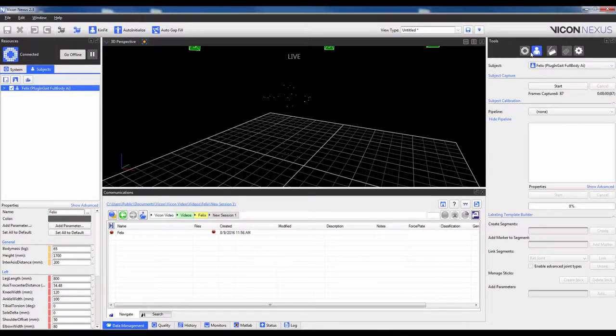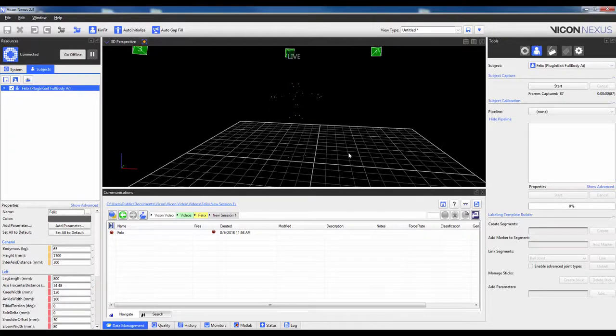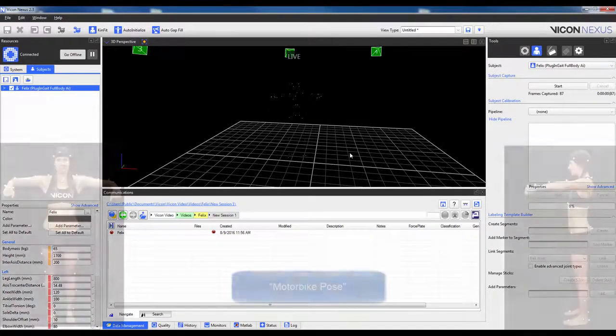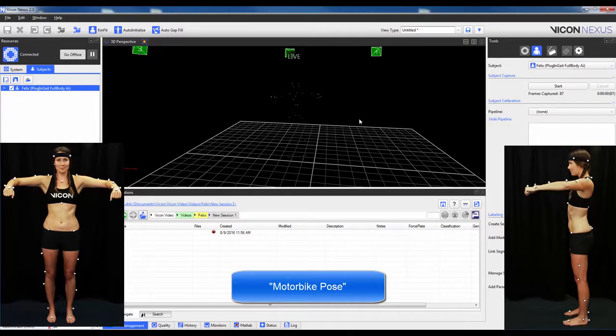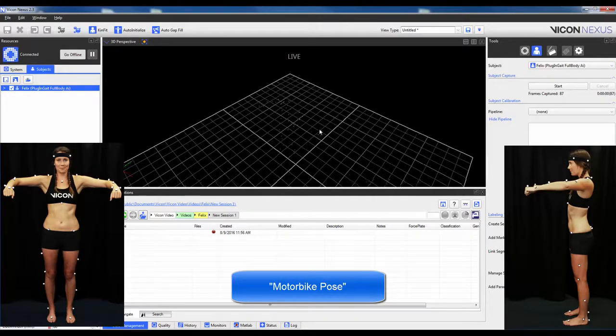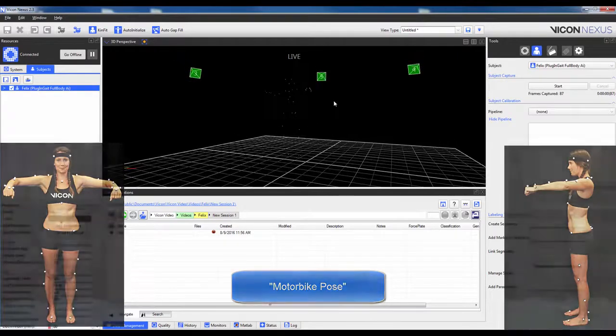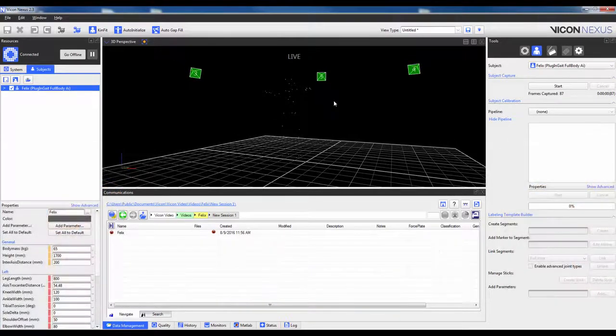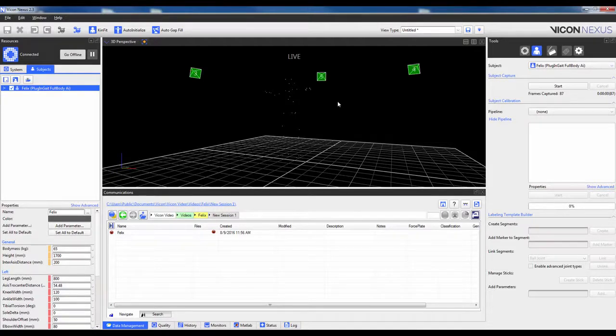When ready to collect the calibration trial, have your subject stand upright with the knees about shoulder width apart. The shoulders should then be abducted 90 degrees with the elbows flexed 90 degrees and the palms facing down. This posture has been termed the Motorbike Pose. This allows the software to recognize the cloud of markers and aid in distinguishing the left from the right side.